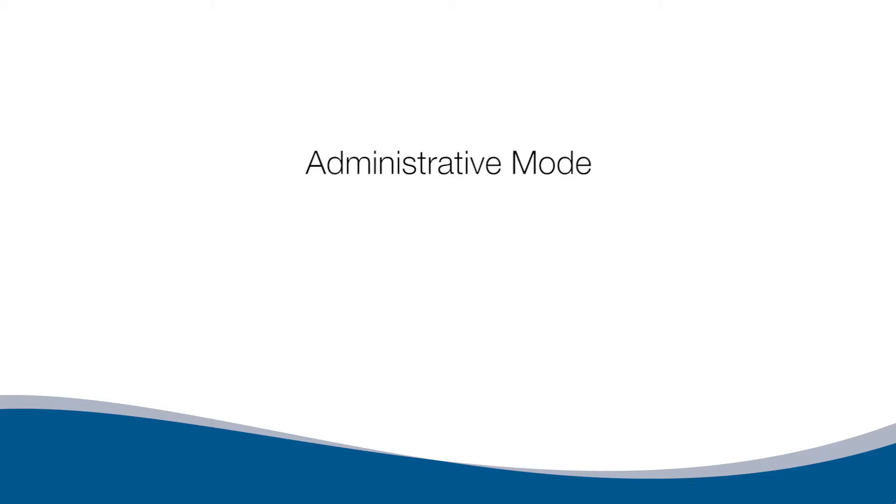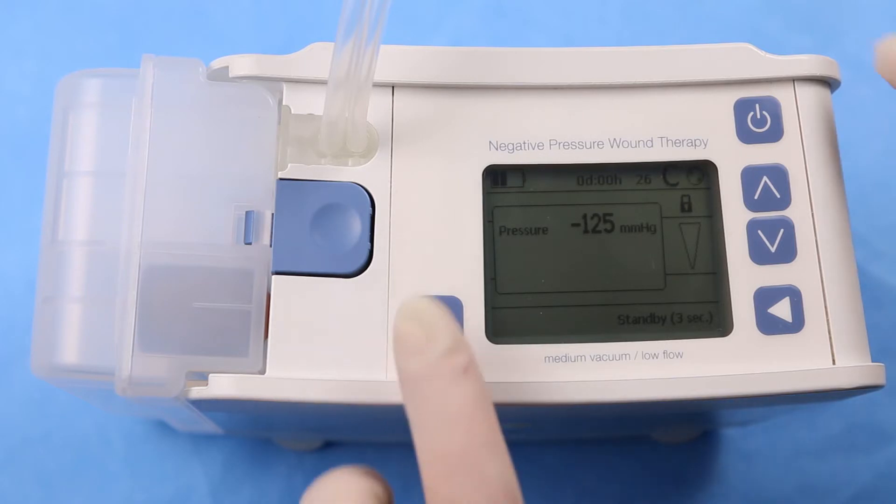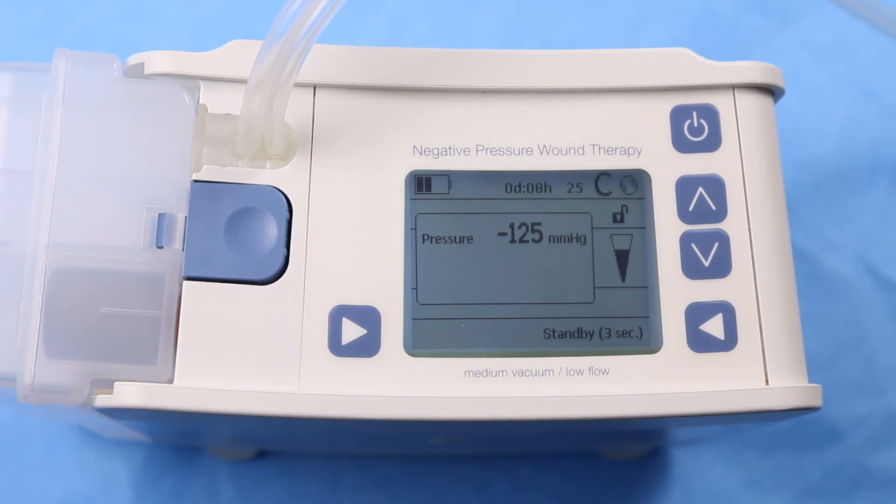Administrative Mode. The Envia Liberty Pump has two different user modes: Administrative Mode and Patient Mode. Administrative Mode is used by the healthcare professional to set up a new patient or change pump settings such as pressure, air leakage volume, therapy mode, language, or time zone. To enter Administrative Mode, press and hold the bottom left button and press the top right button. The lock on the screen will be in the unlock position when in Administrative Mode. One minute after the last button is pressed, the pump switches into patient mode automatically and the display is locked. The backlight turns off one minute after the last button press, and will illuminate when the pump alarms or any button is pressed.